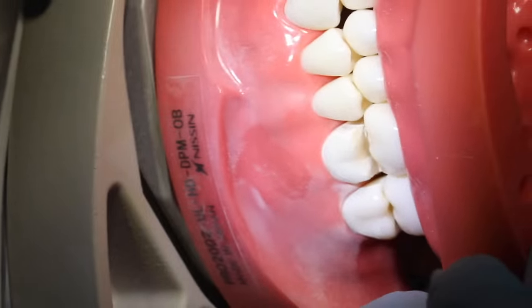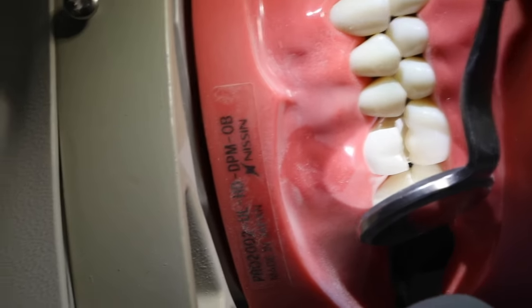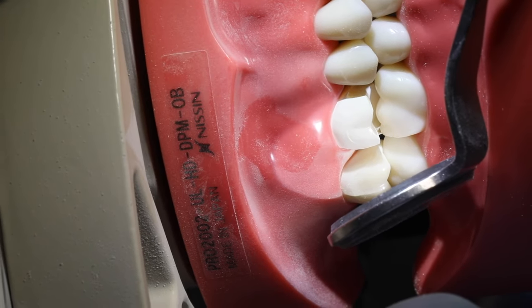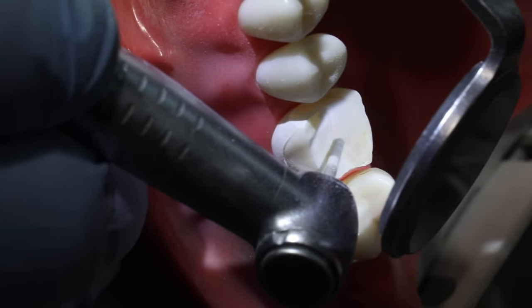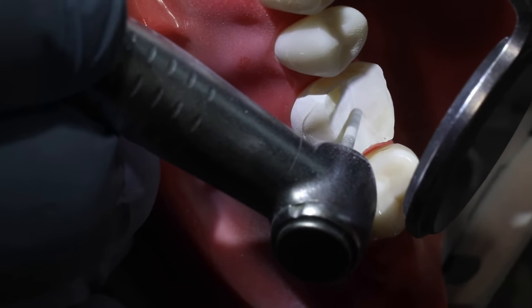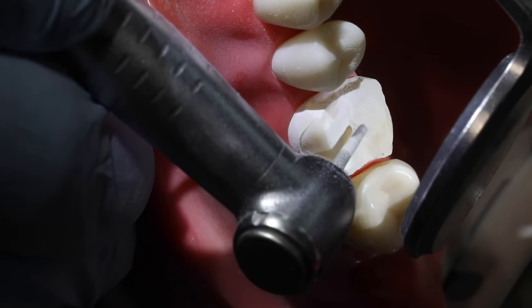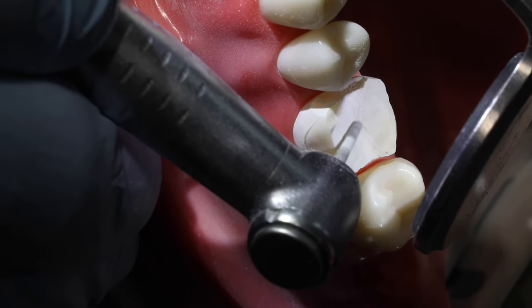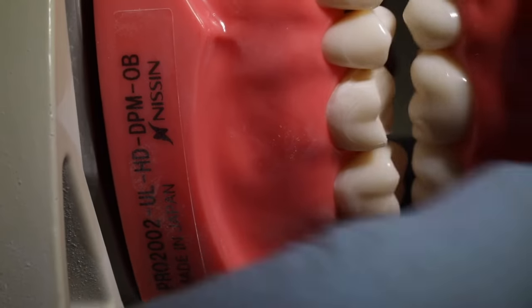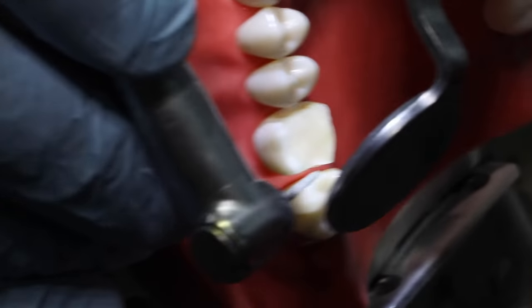Check clearance here. We're getting close. We could take a little bit more, especially toward the distal again. So I will take more off back here. Just a little air. Let's see how our clearance is coming there. Again, a little tight toward the distal, so we'll continue taking that down a little bit more.